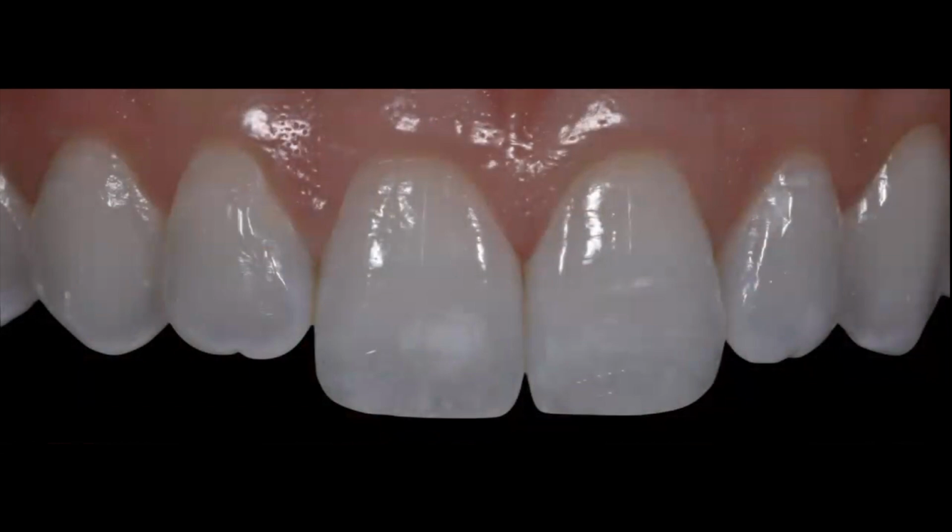The patient had already bleached her teeth on her own. So when she came to me, she had very light teeth. So the bleaching wasn't going to do anything for her. So I knew that the next thing that I would do was think about microabrasion or resin infiltration. How did I make the decision here? Again, the opacity of the white spot. In this particular case, it wasn't that opaque.